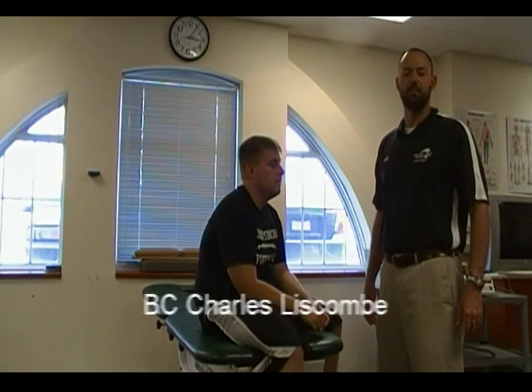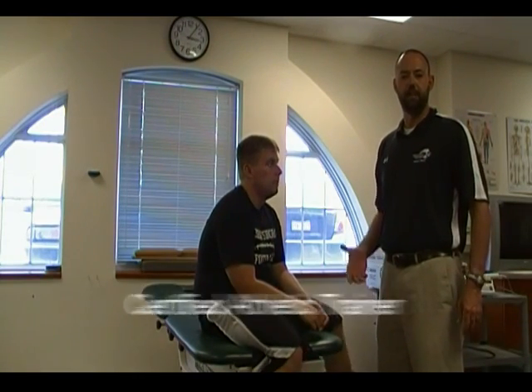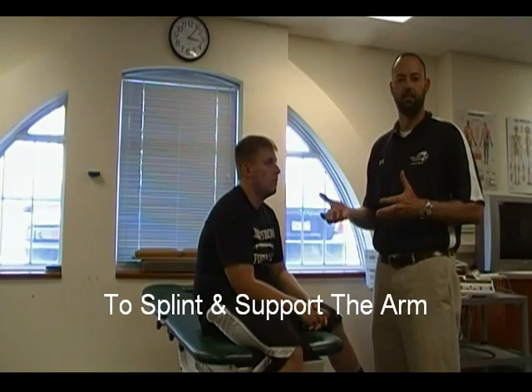Hi, this is B.C. Charles Liscombe. I'm an associate professor of athletic training at Greensboro College. Today I'll be demonstrating how to use a variety of ace wraps for splinting the wrist and hand.